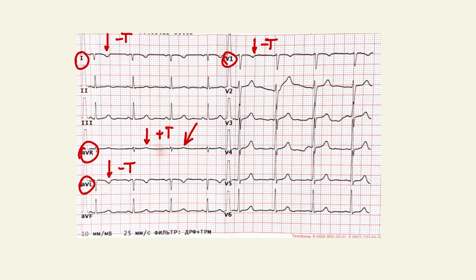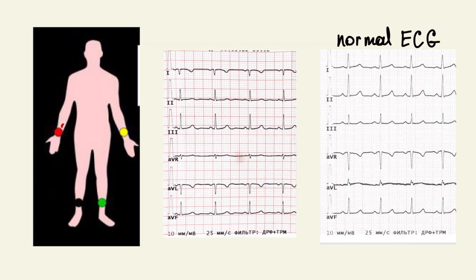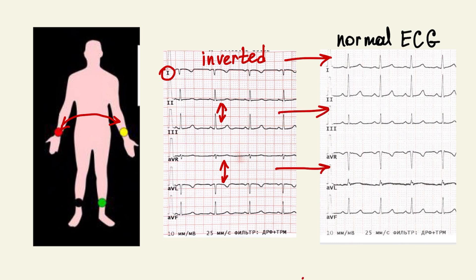All these features tell us that this is limb lead misplacement — specifically a swap of the right arm and left arm electrodes. Lead 1 becomes inverted. Lead 2 and lead 3 switch places. Lead AVL and AVR switch places. So this is an ECG with incorrect electrode placement.